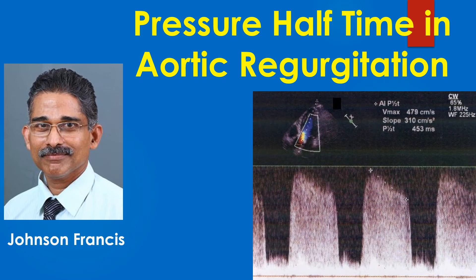Pressure half time of the aortic regurgitation jet is measured from the apical 5-chamber view using continuous wave Doppler echocardiography. PHT decreases as the severity of aortic regurgitation increases.